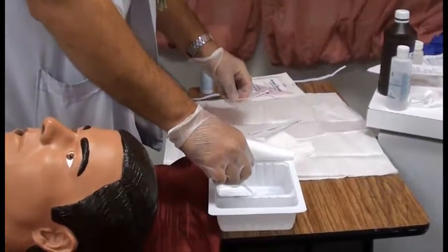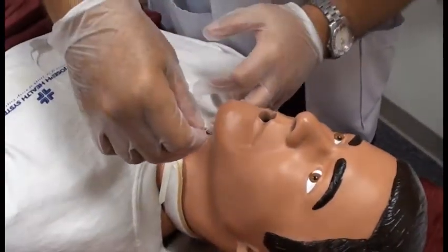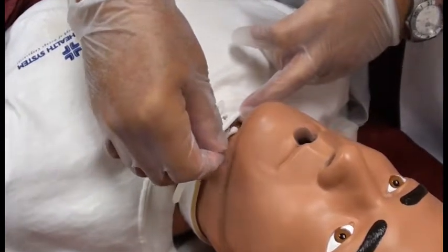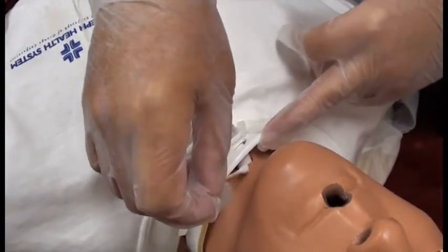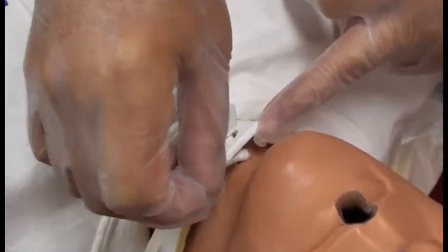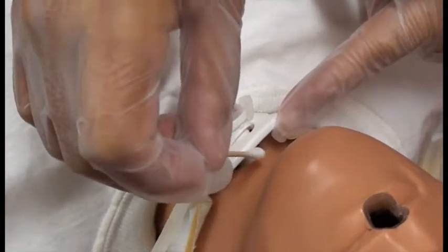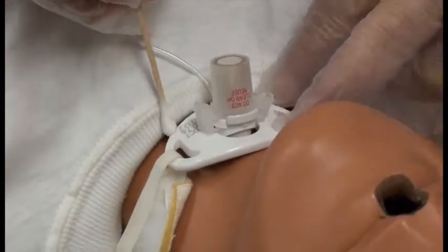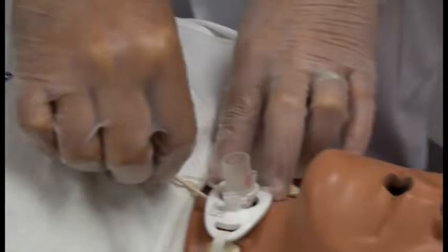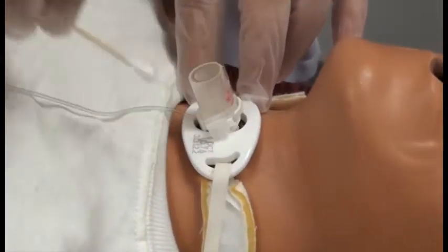And how we do that is dip the cotton tip applicator, and we're going to clean top to bottom. Make sure that we're removing any secretions or phlegms. And while we're doing that, we're also going to be observing, making sure that there's no redness, tenderness, or any unusual odor that we see at the trach site itself. And also make sure that you clean the bottom part of the trach site, because that's usually not easily visible, and we'll make sure that that's very clean as well.